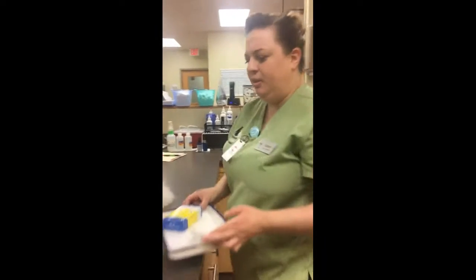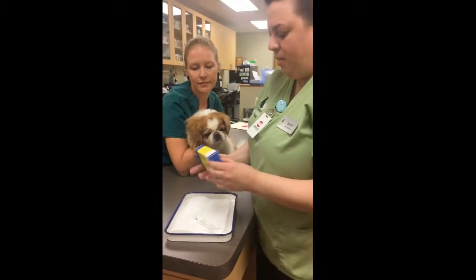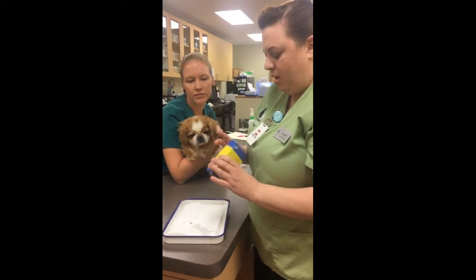So we have our tray of supplies here. We have our box of Schirmer ophthalmic strips.